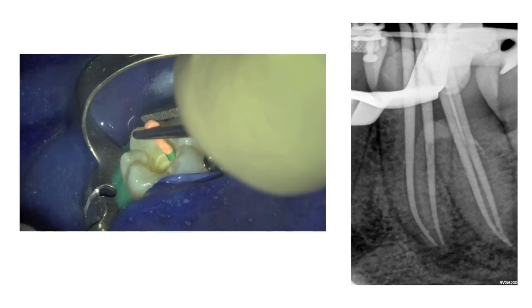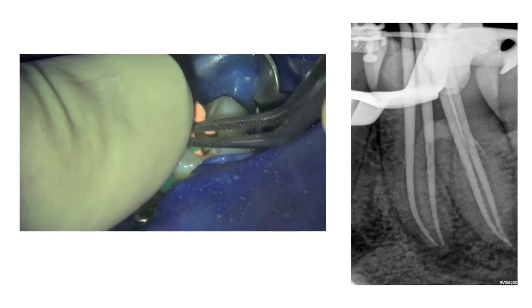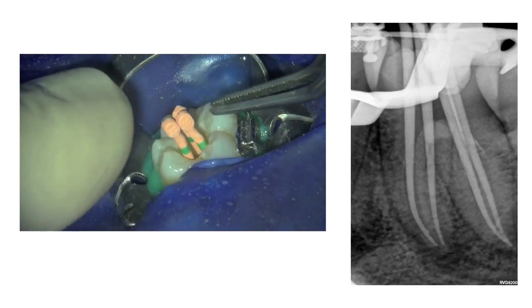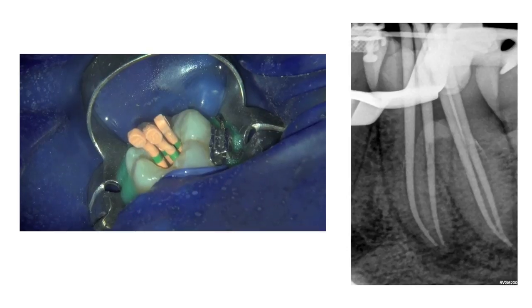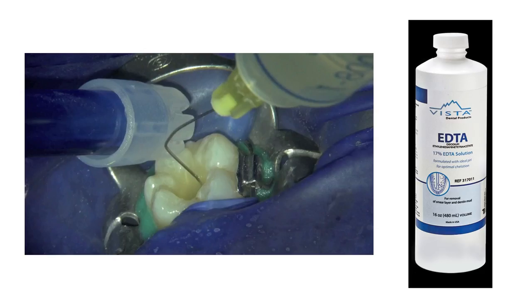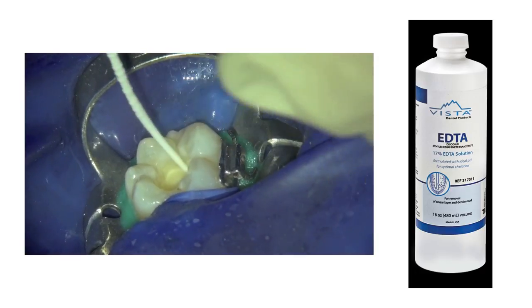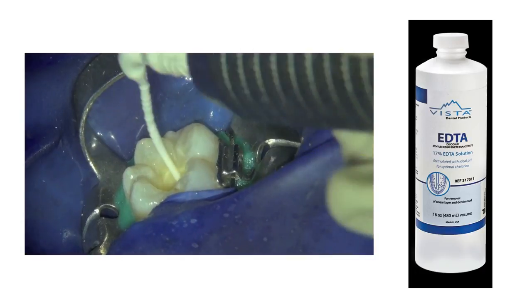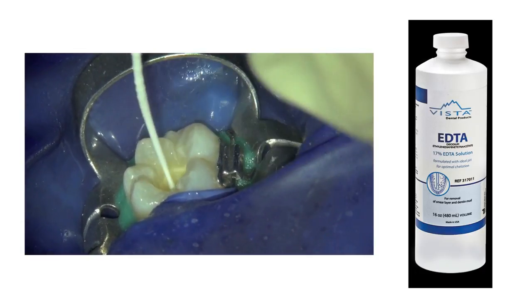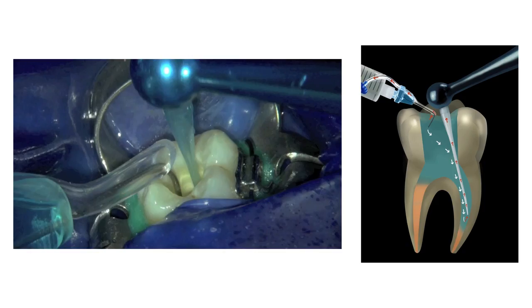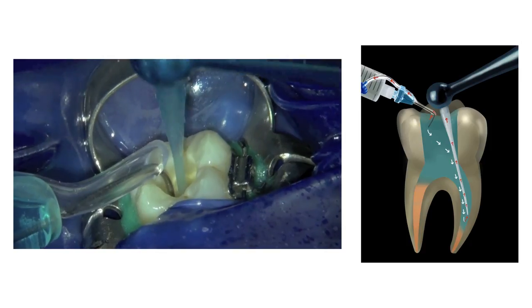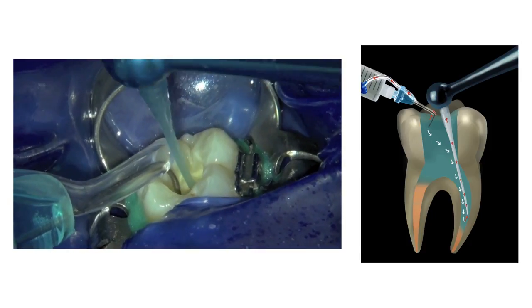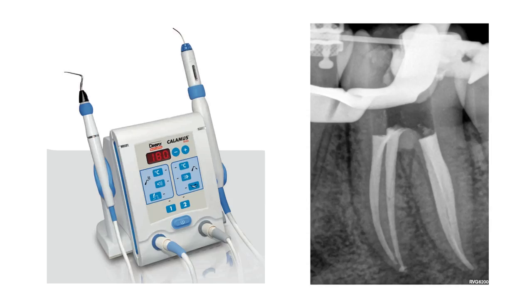After root canal preparation, four size medium WaveOne Gold gutta-percha points were fitted into the prepared root canals and the fit of the cones was verified radiographically. The canals were filled with 17% EDTA and the solution was activated with the EDDY irrigation device from VDW for approximately 2 minutes to remove the smear layer. This was followed by a final irrigation step using heated 3.5% sodium hypochlorite in the EndoVac system. After irrigation, the canals were obturated with the gutta-percha points and pulp canal sealer using the Calamus dual obturation unit in a continuous wave of condensation mode.